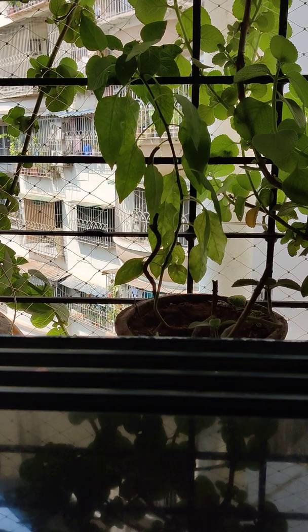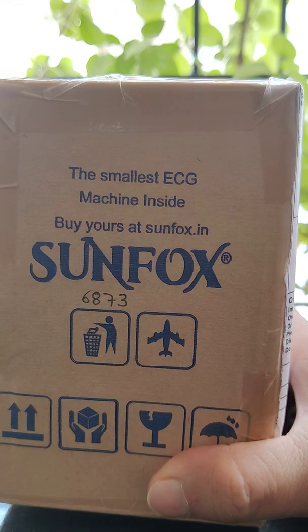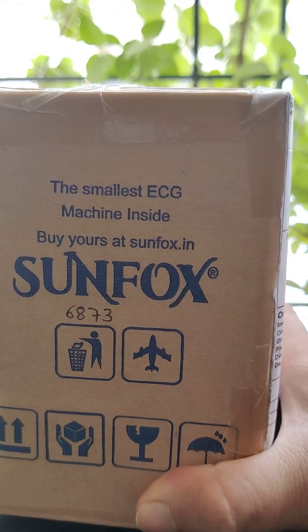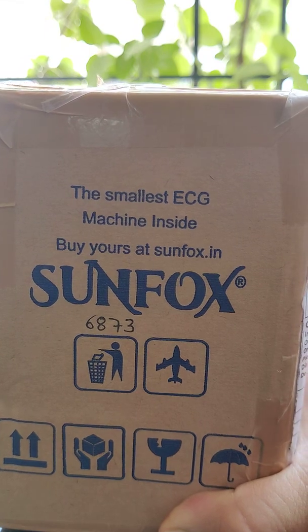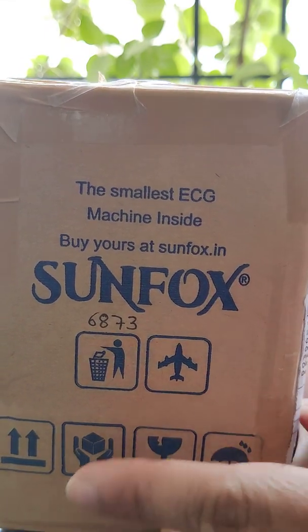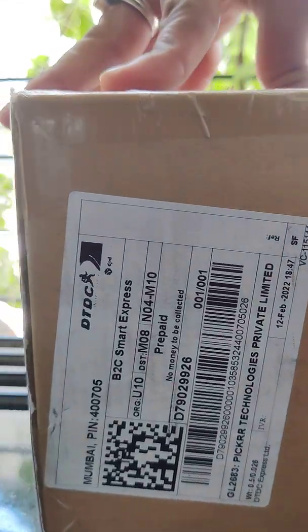Hello guys, today we are unboxing the new Sunfox ECG monitor. It is an ECG device which they claim is the smallest ECG machine, and I think they have also been featured in Shark Tank India Season 1. I had ordered from the Sunfox website itself and received this box a couple of days back.